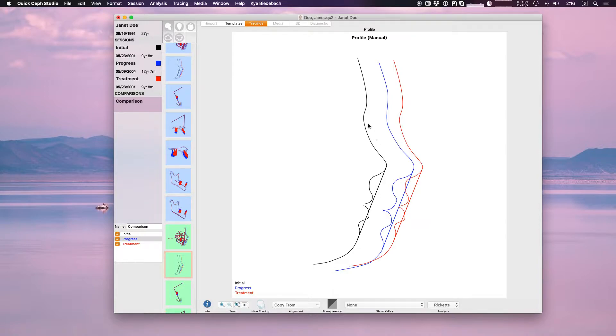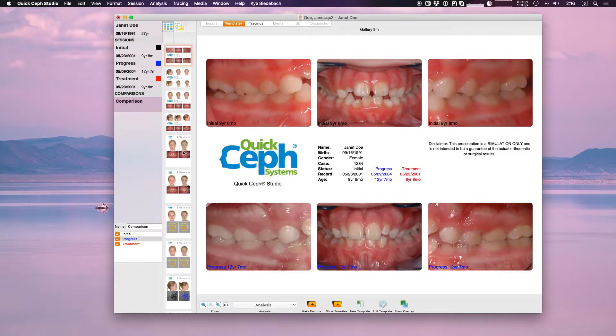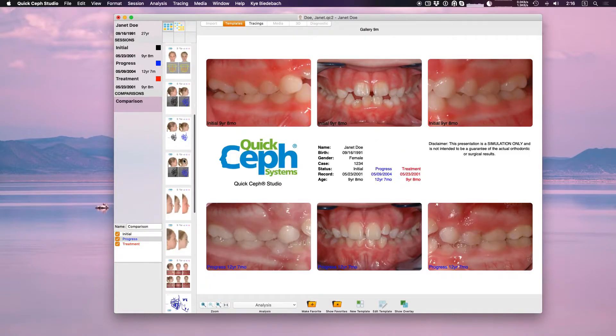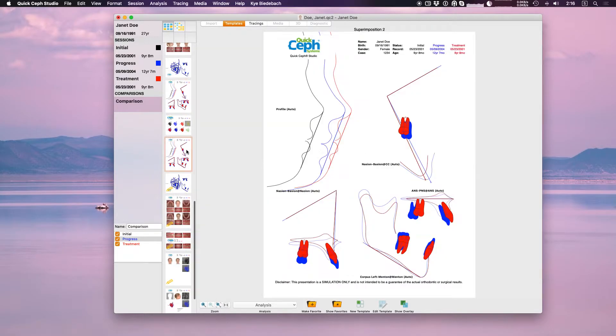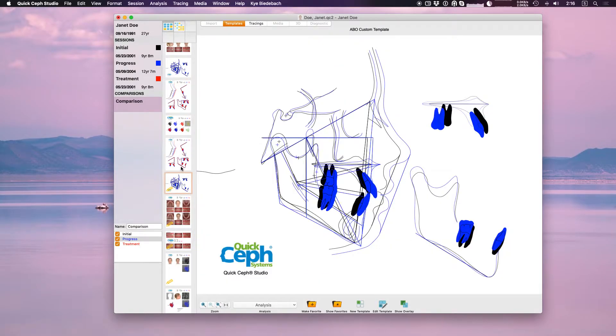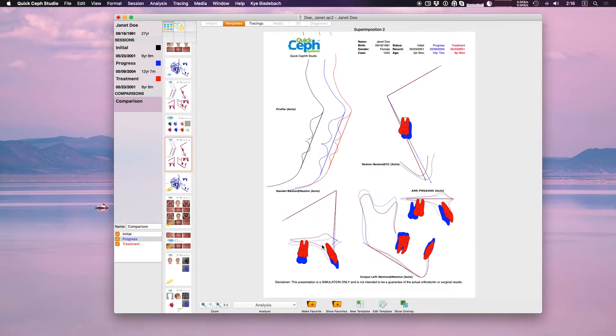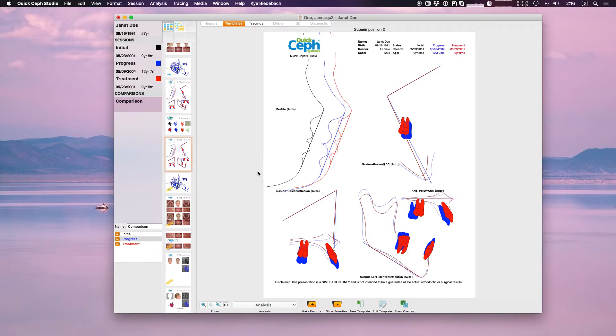Keep in mind you can also add these manual superimpositions to one of your comparison galleries. We have these different superimposition galleries already built in, but you can create your own or edit these and change them around from the automatic superimpositions to using the manual superimpositions. If you need more help with this there's a tutorial video about editing a custom gallery.